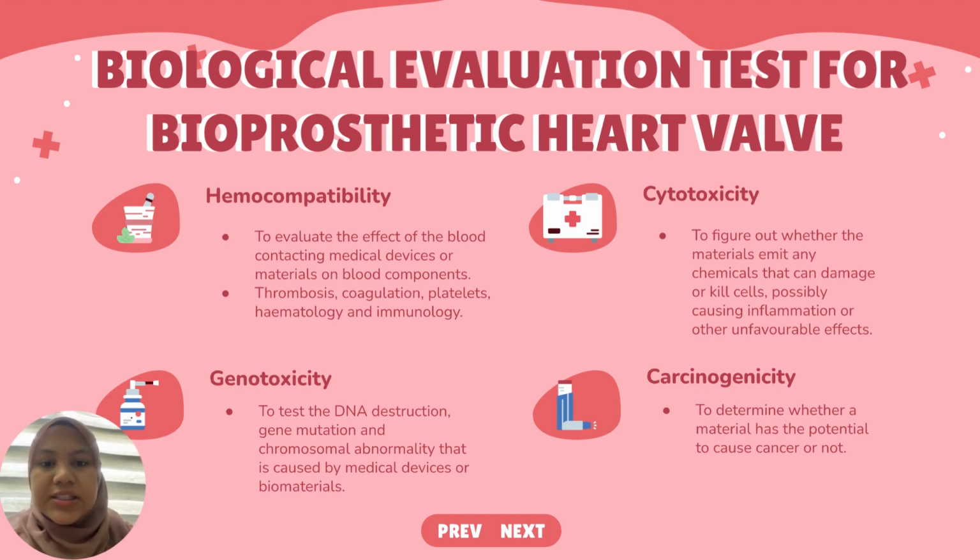The last one is cytotoxicity. It's to figure out whether the materials emit any chemicals that can damage or kill cells, possibly causing inflammation or other unfavorable effect.